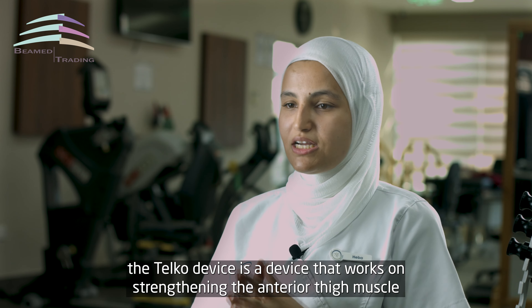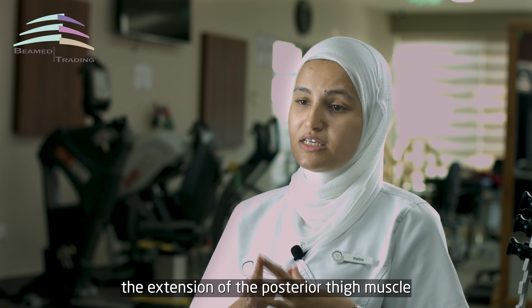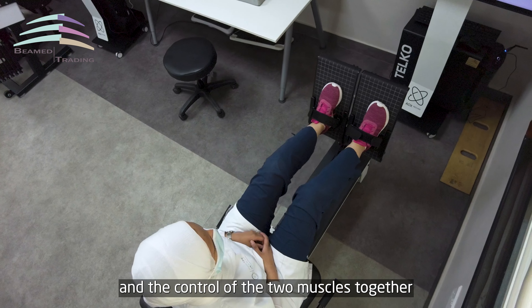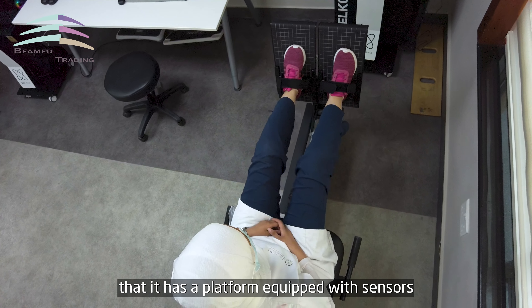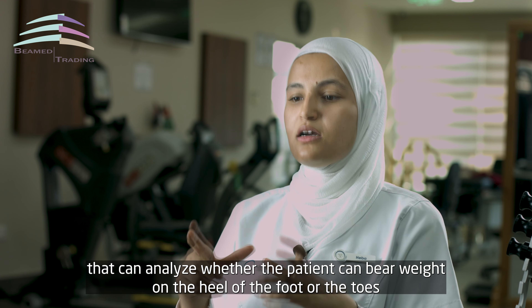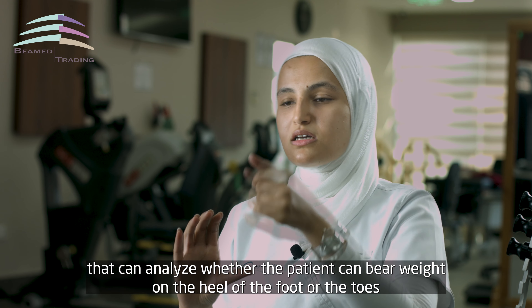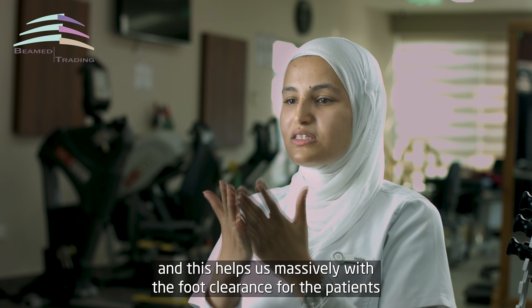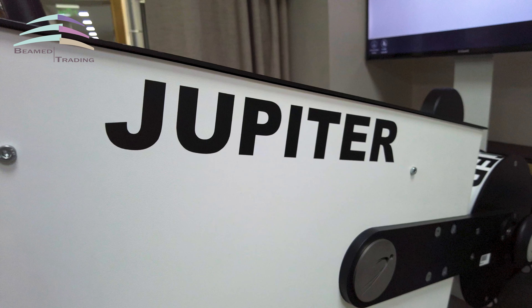جهاز التلكو هو جهاز بيشتغل على تقوية عضلة الفخد الأمامية وبسط عضلة الفخد الخلفية والتحكم بالعضلتين مع بعض. كمان في شي بيميز جهاز التلكو إنه في بلاتفورم مزود بـ pressure sensors بيقدر يحلل لنا المريض هل عنده قدرة على إنه يحمل وزن على كعب القدم أم على أصابع القدم، وهذا الشي كتير بيفيدنا بالـ foot clearance عند المرضى.